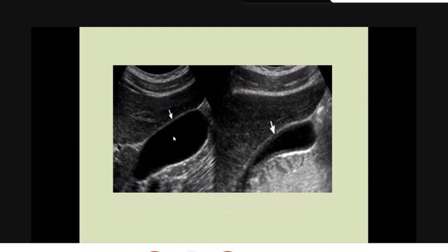A thick, echogenic gallbladder wall with a hypoechoic margin can be identified in about 50 to 70% of the cases. Thick, echogenic gallbladder wall with a hypoechoic margin. Other signs indicate indistinct contour to the gallbladder wall, a fluid around the fundus of the gallbladder.